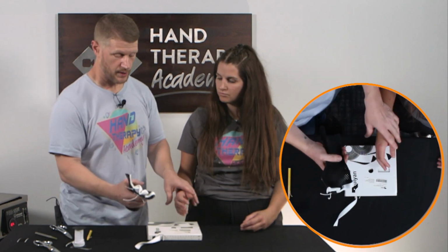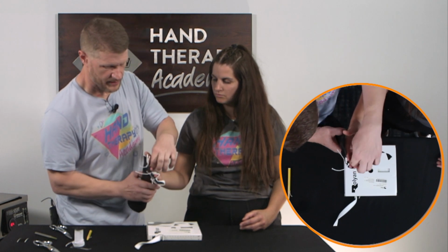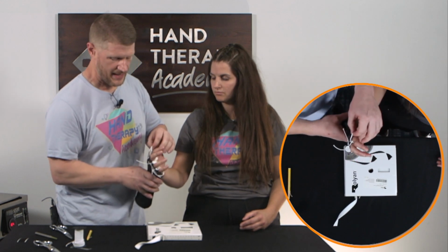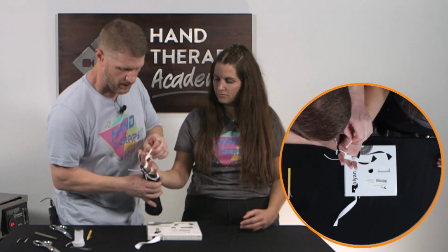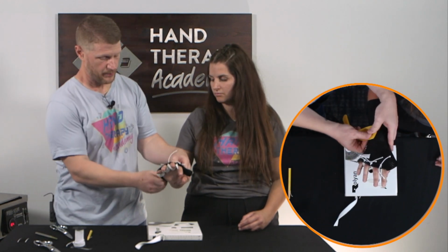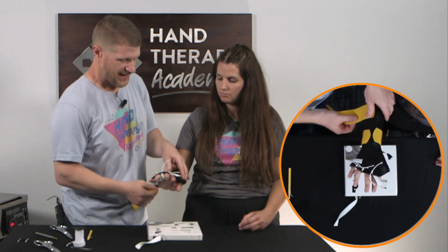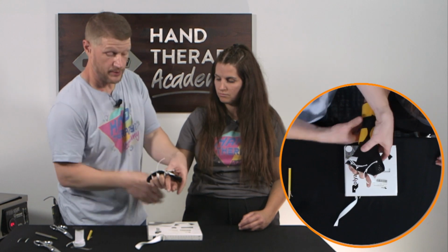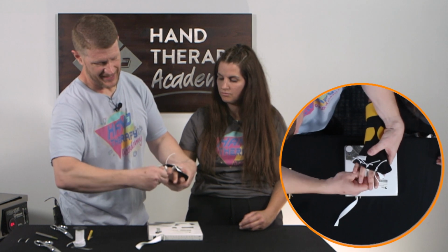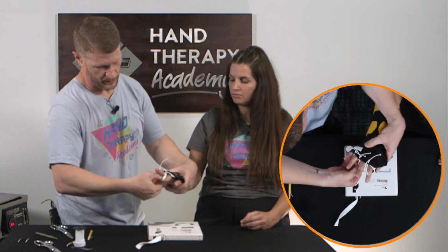With the patient, what I'll do is work on feeding small, ring and long finger through these slots. And I want to make sure my strap is flat, okay? So we're going to feed through here, and then this other one loops around the index. But before I get there, I'm going to put my straps on to anchor the wrist in place. 1 and 2. That just means one less thing I have to hold on to because their wrist is going to drop. So I've got this tension here. Now I just pull to tighten on small finger as much as I need. I pull to tighten on each of them as I work around the line, right?